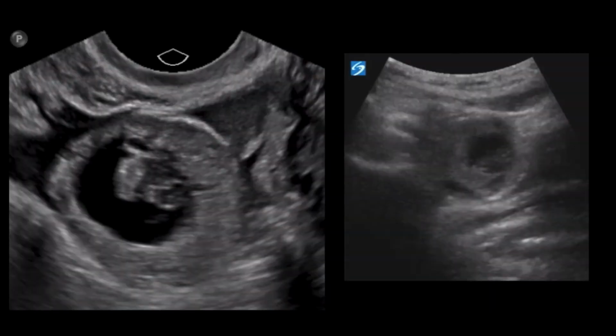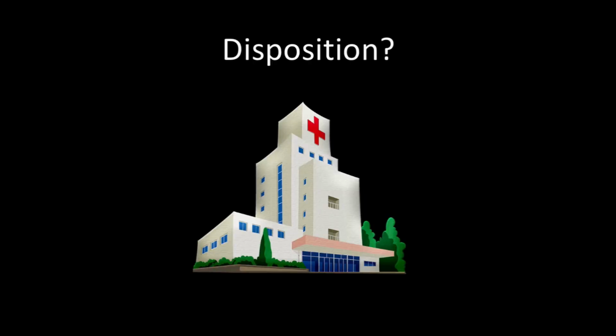When comparing the transvaginal versus transabdominal views, the resolution difference between the two is remarkable. The clarity offered by the transvaginal ultrasound is secondary to the lack of tissue attenuation, along with the higher frequency property of the probe. Mastery of transvaginal imaging is surprisingly easy, and I encourage learning the skill given the improved information the modality offers. Given the diagnosis of an ectopic pregnancy, the OB service was consulted.